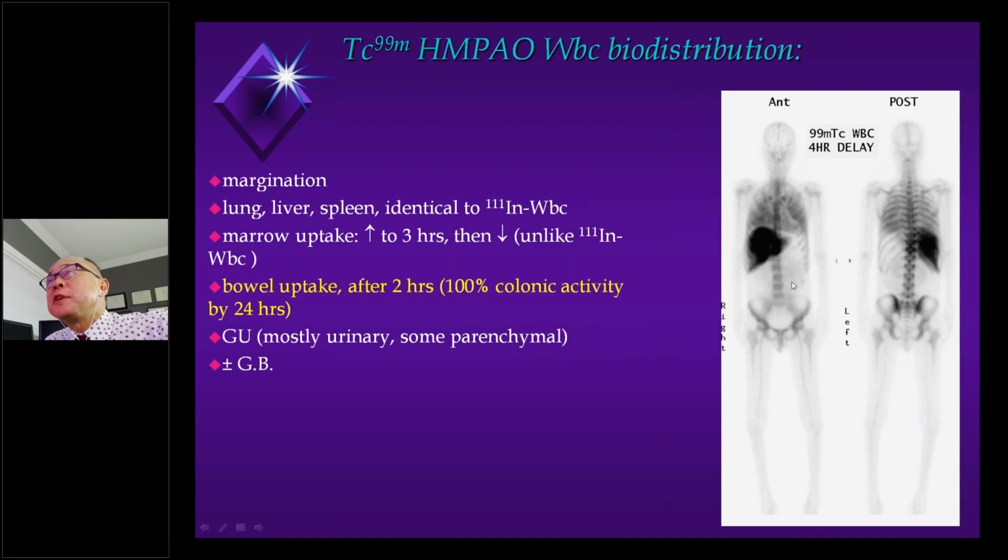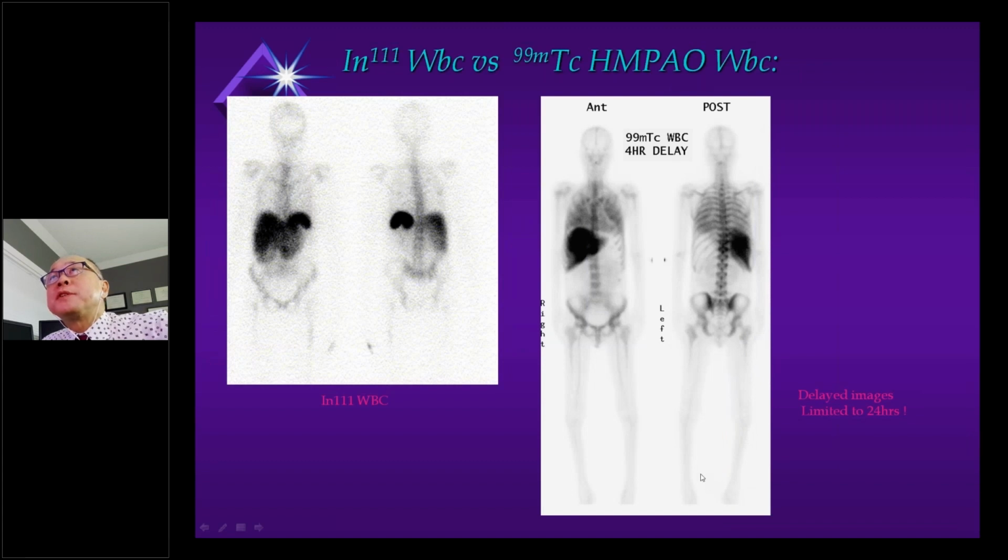You don't see bowel activity here, but you certainly can see some bowel activity on a physiologic basis. So between indium and technetium, we much prefer the technetium. We prefer it for several reasons. You know, the technetium is a far more pleasant nuclide for imaging.